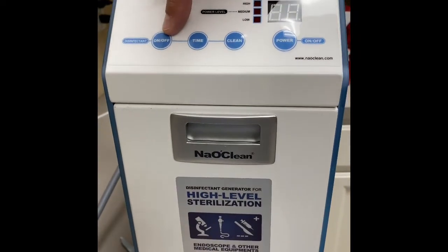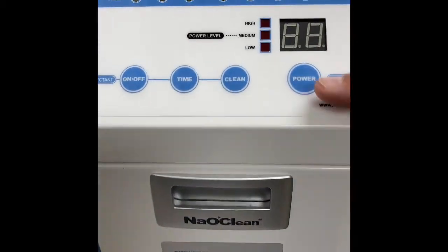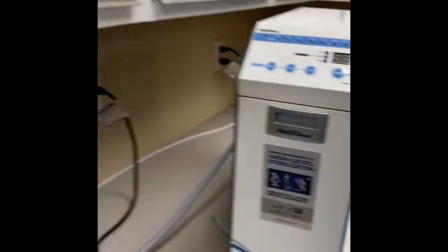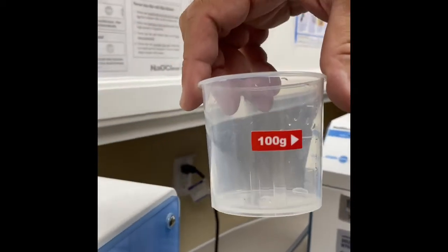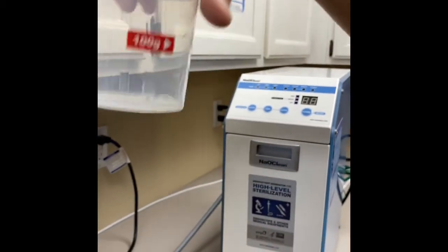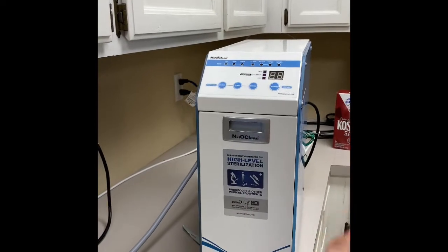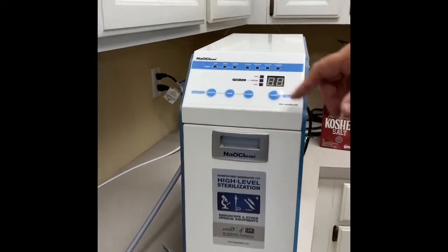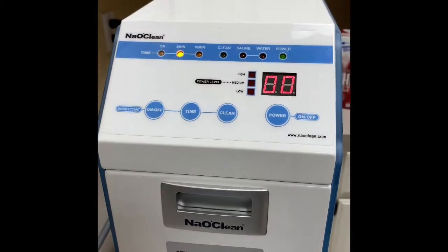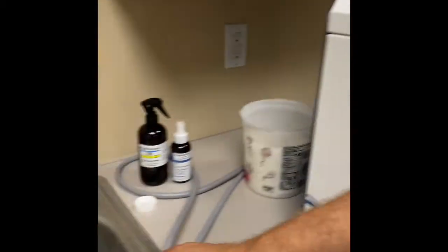Here's your on/off button for your disinfectant — we're going to make some solution now. We've got the brine tank, we mix the salt — two cups measured with the little cup measure that comes with the machine, which is 400 grams of salt. Fill that cup to the top level, pour it in, and shake it really well to make sure it's nicely dissolved. Then you're ready to go. Turn the machine on — very simple to operate — now turn on the disinfectant, and we're making the solution.